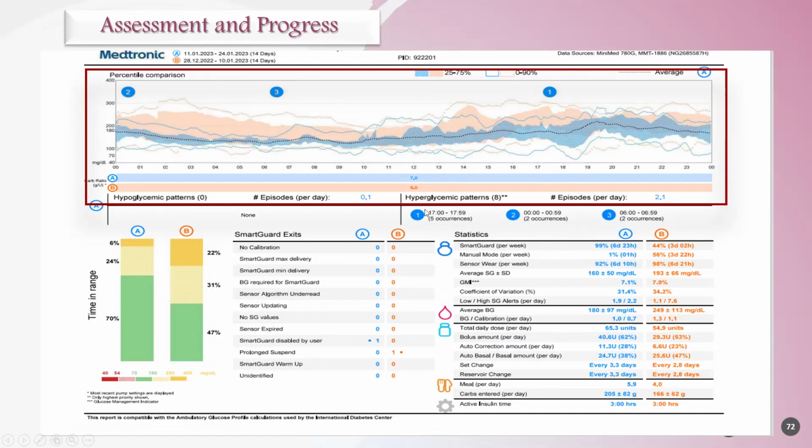So I will go from this information. I will go back and see in the other records to support my idea. Is it a problem of carbs, or what is it exactly?